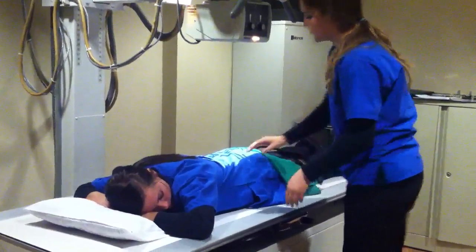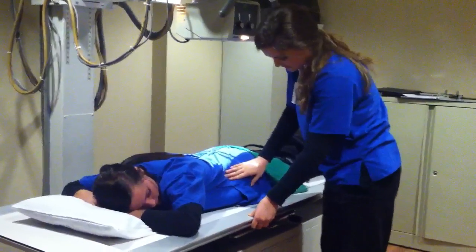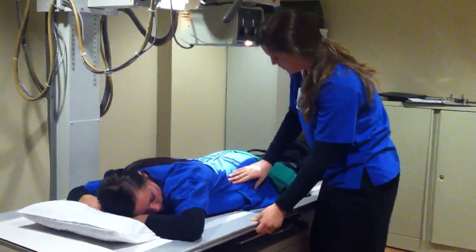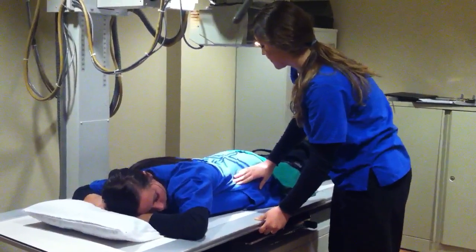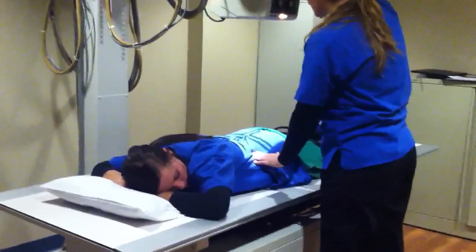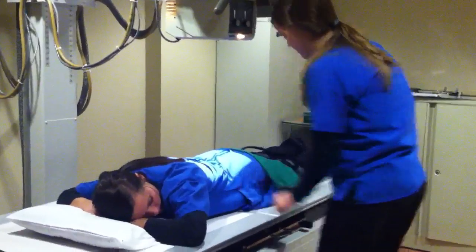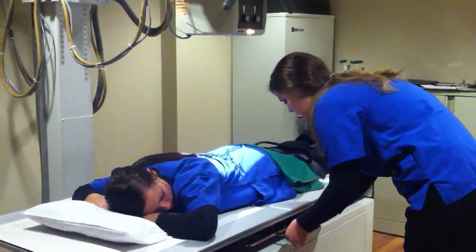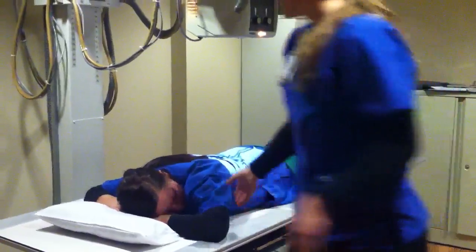I'm going to center my central ray to the midline and to the level of the iliac crests. This will include the stomach especially, but every projection that you take should include the diaphragms down to the pubic symphysis. Make sure she's lined up.